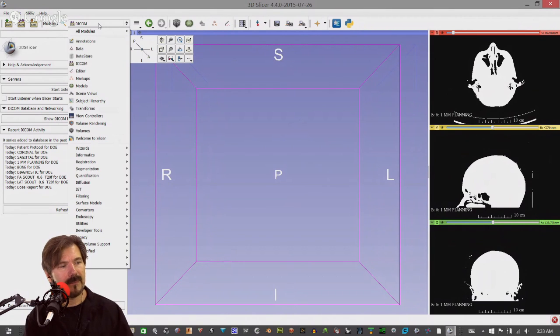I'm assuming from my understanding that, at least on scanners that can do 1 millimeter in the last 2 or 3 years, not the latest generation, it still takes longer than a 3 millimeter because you're taking more slices, if I understand correctly. And there's still time that's required in order to process it.